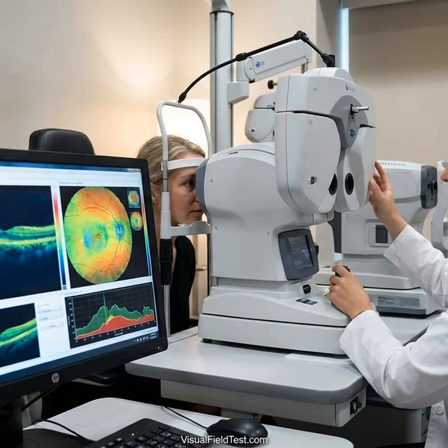Overall, OCT gives doctors precise physical data, how thick or thin the nerve layers are. These numbers let doctors track change more objectively than subjective exams. OCT in suspected pre-glaucoma conditions. Even before glaucoma is officially diagnosed, OCT can be very helpful. This is often called preperimetric glaucoma, where the optic nerve looks suspicious, but standard visual field tests are still normal. In such cases, OCT often picks up early damage.